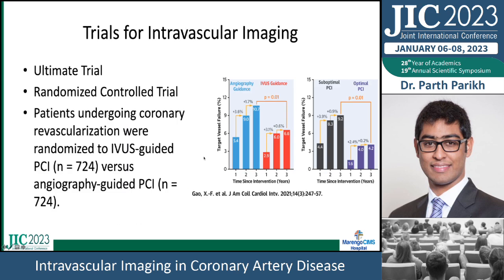In terms of trials of intravascular imaging, there are multiple trials that have shown the role and benefit of intravascular imaging. One of the trials is the Ultimate trial, which was published in JACC Intervention in 2021, one of the more recent trials.